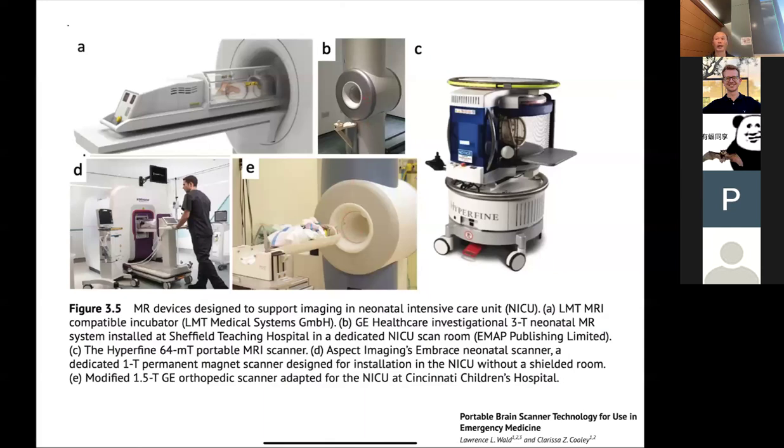The idea is you want these smaller footprints, and it also means you could situate this in the NICU, right? You could put it where the point of care is, as opposed to having to take the baby all the way down to the MRI suite, which might be many floors away. So you can reduce costs and also have a better experience by having special case magnets.